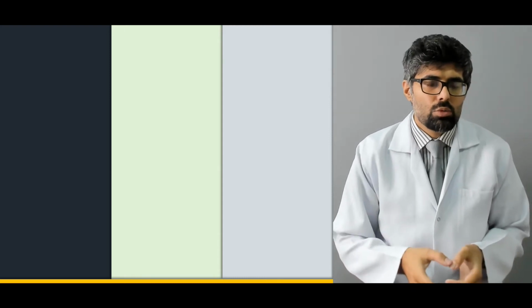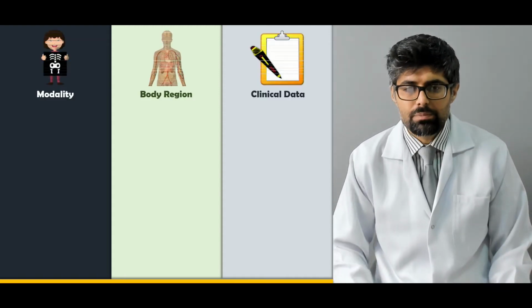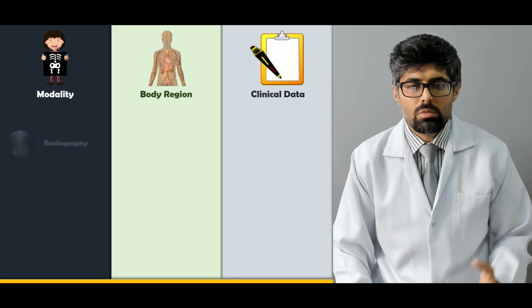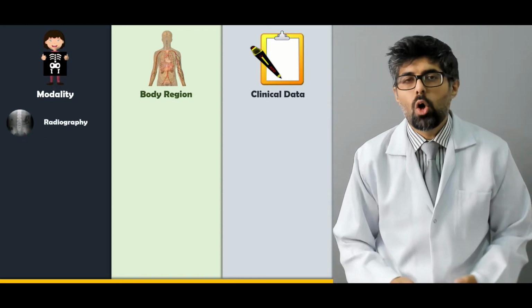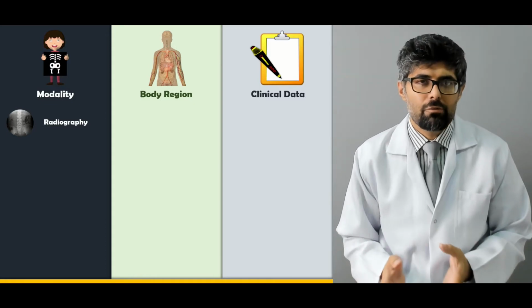So a good doctor must be able to discern the abdominal X-ray. Which modality should we use in which case? Here is an example. First of all, we have the normal radiography, the normal X-rays that we use.